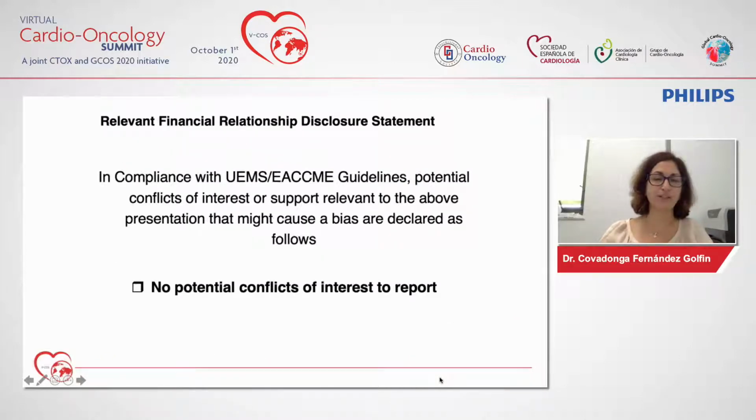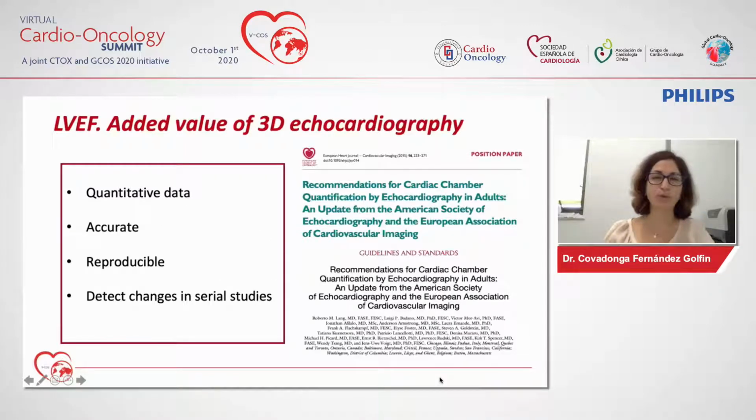First of all, before we move on to the clinical case that will be in a minute, I would like to remind you the importance of the evaluation of LV ejection fraction in our patients, not just to evaluate the left ventricular systolic function, but to have in mind the important issues that we have to answer every time we face one of these cardio-oncology patients in our everyday clinical practice.